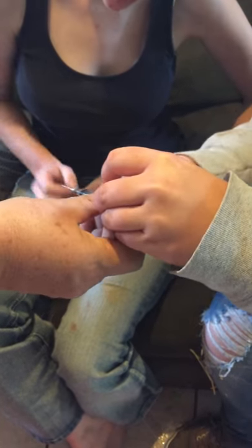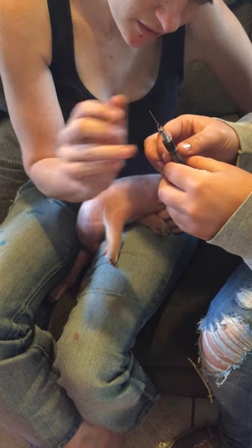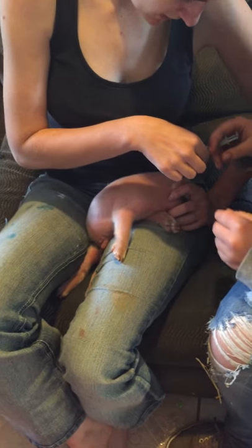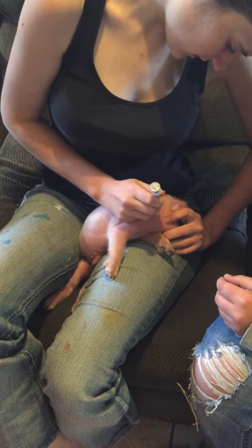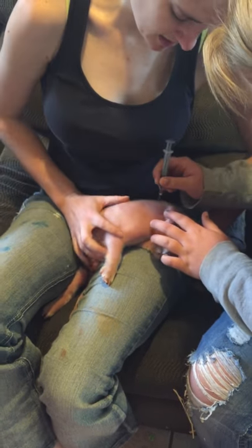You don't have to go in all the way. You just have to at least get this part of the needle in — just that tiny little bevel. You're going to just come in; you don't even have to go at an angle. You can go straight in, like so, and pull. You just want to make sure you get that tip of it.